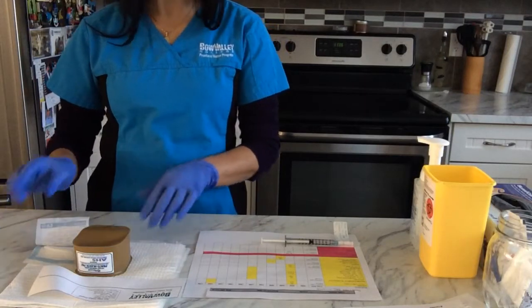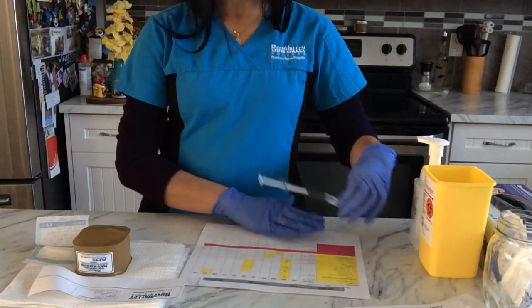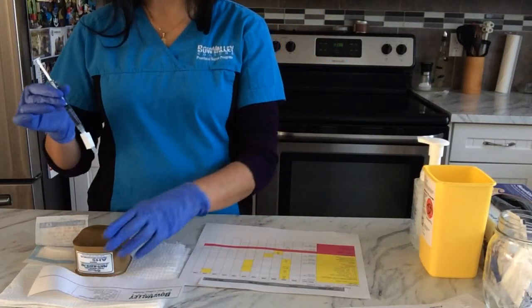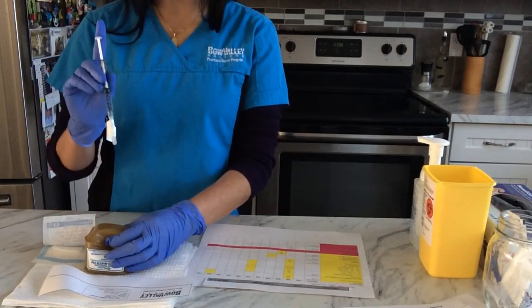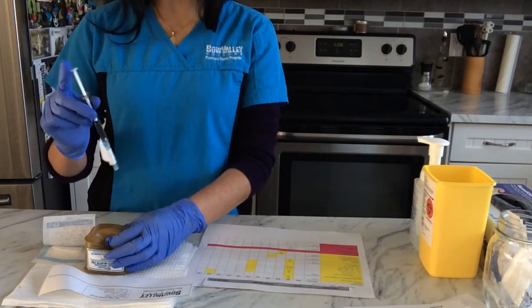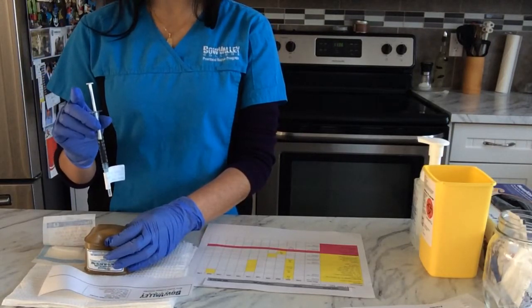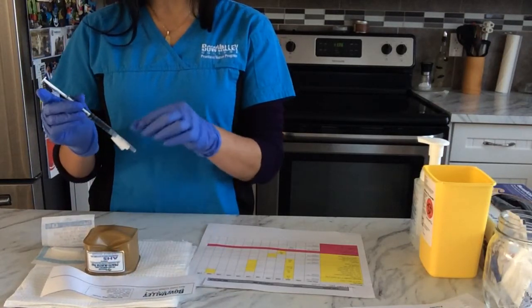I have this one ready here, and I'm gonna pinch 1 inch, and then I will go in at a 90-degree angle for subcutaneous, or 45. In this case I will go for 90 degrees.